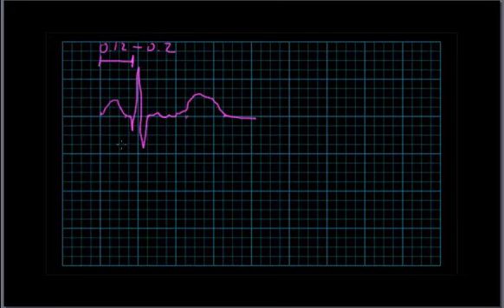In somebody with what we call a first degree AV block, that is, there's something wrong with the AV node or the junctional fibers leading into the AV node, and our signal is not making it into the ventricles as it should, and there are lots of things that can cause these blocks, various pathologies, disease conditions.